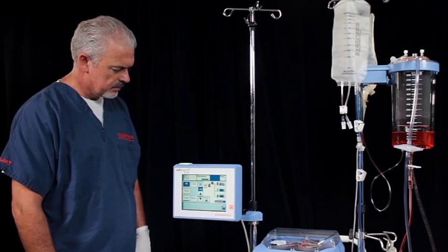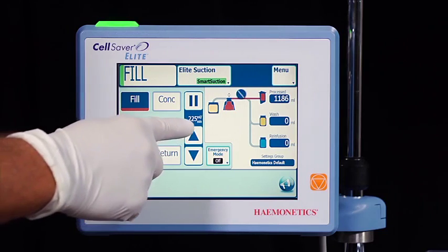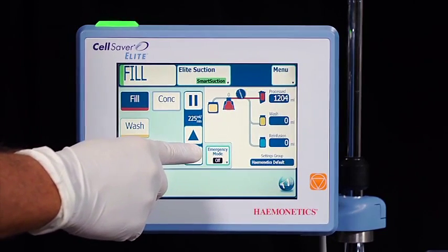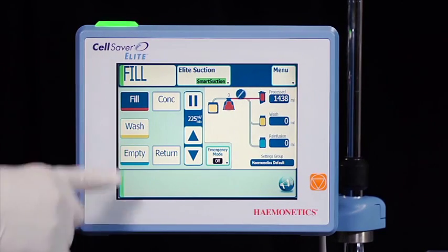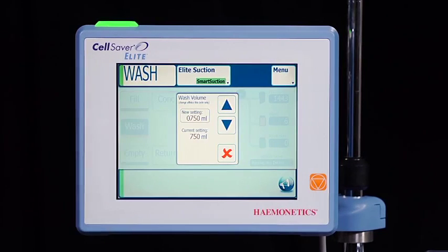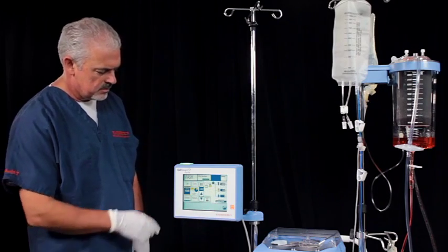CellSaver Elite has no manual mode, but changes can be made manually during processing. Touching the up or down arrows will change the pump speeds. The changes will be shown in the box. During wash, wash volumes and wash progress will be displayed. Touching the wash icon box will bring up a screen where the volume can be raised or lowered for the current bowl. These changes will only last for the bowl being processed.